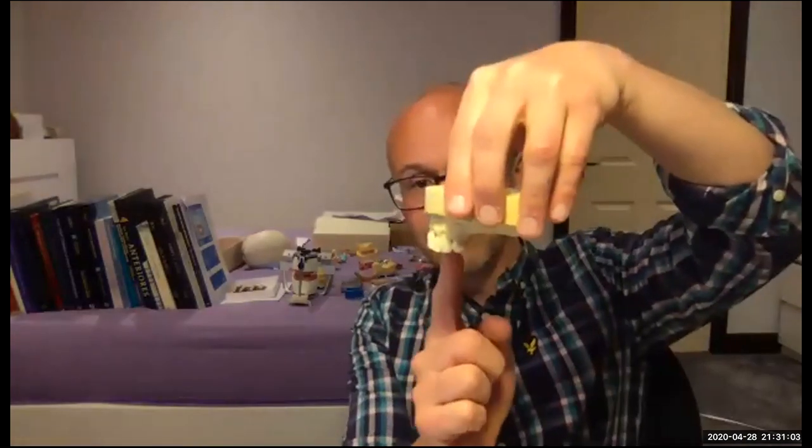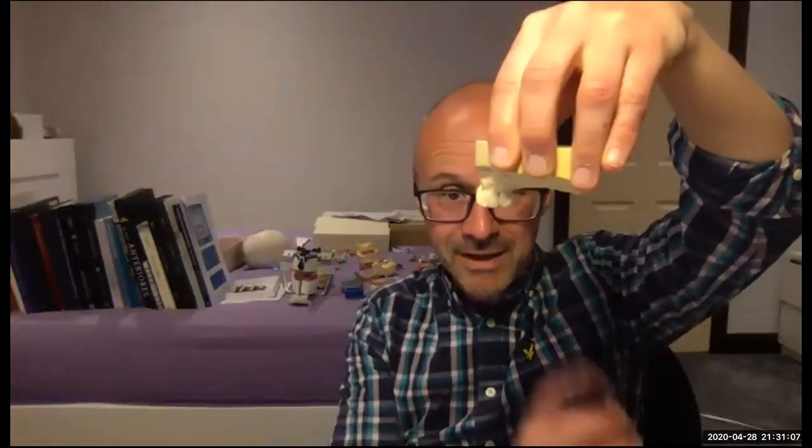But if I'm conforming to ICP, then I use Futar D with wax blocks. It's very, very much case dependent. But generally, the more natural teeth the patient has, the more likely I am to conform to their intercuspal position. And the less teeth they have, the more likely I'm needing to record CR because there are no intercuspal contacts anymore. And then the wax rims have to be used for recording the occlusion where people have got missing teeth so that we can approximate those. I'm sorry I'm making a meal of answering that question, but it's very much case dependent.